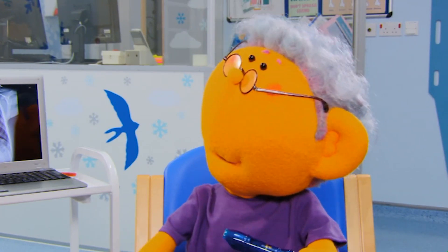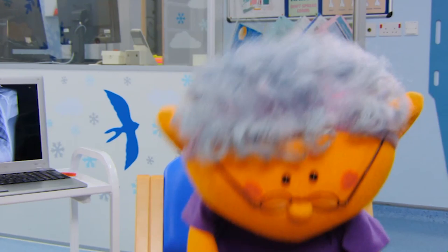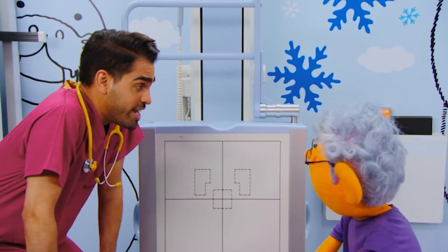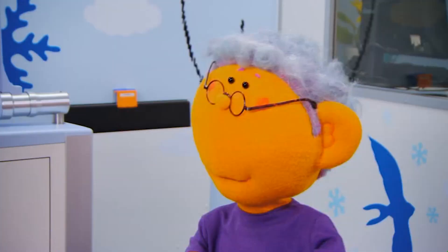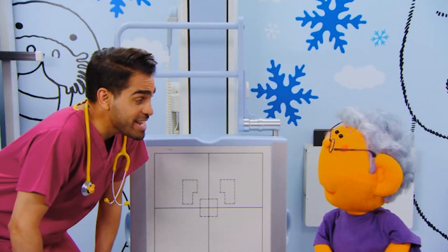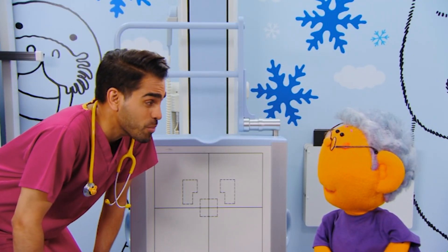Can we do the X-ray now? OK, if you're ready. I was born ready, Dr. Ranj. Right then. First, I need you to stand in front of this screen. Is this going to hurt, Dr. Ranj? No, Riz, you won't feel anything at all. This is my favourite T-shirt, Dr. Ranj. Do I need to take it off? Don't worry, it won't do anything to your T-shirt either. But you will have to take it off so we can get a clear picture.